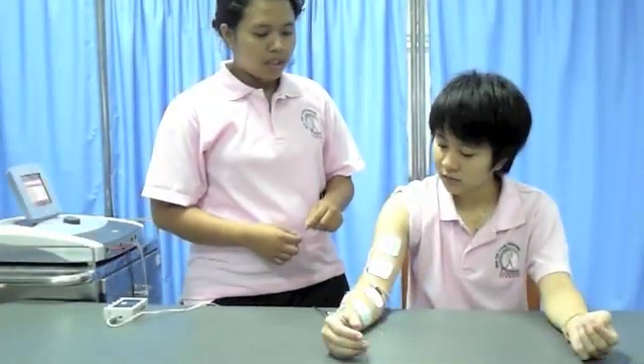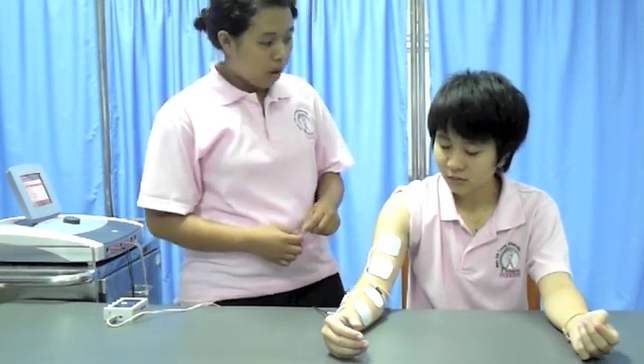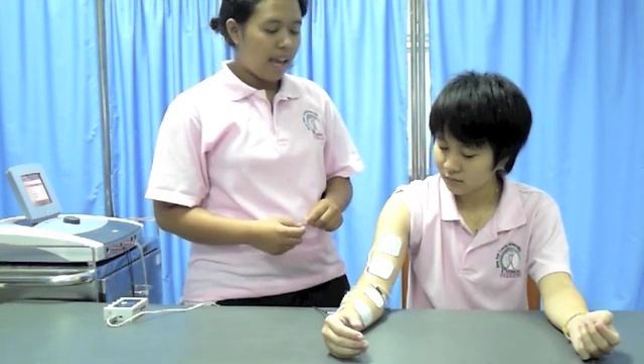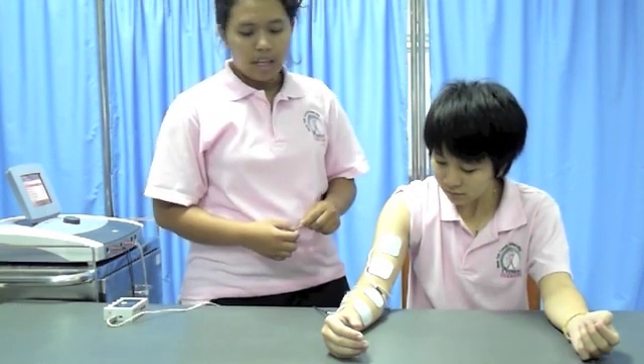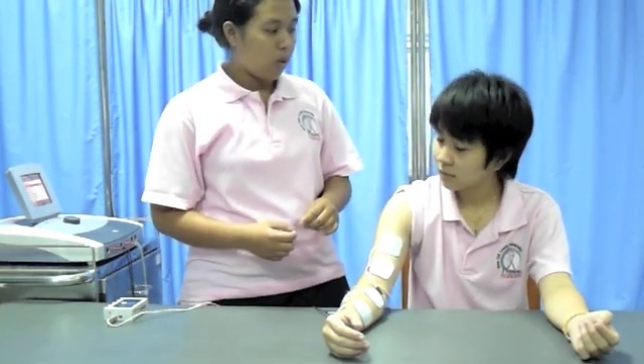Then I will increase the intensity of the electrical current on the flexor movement of your forearm. The action will be wrist flexion and finger flexion. And the last channel is on the bicep. The action is elbow flexion.